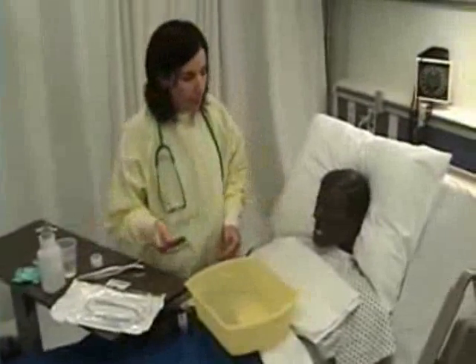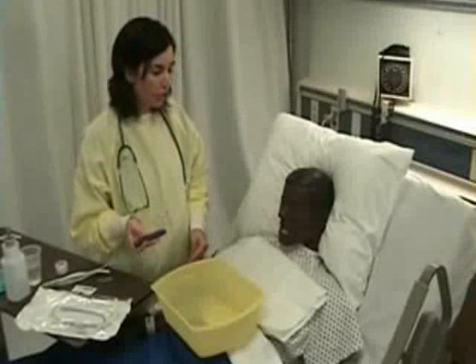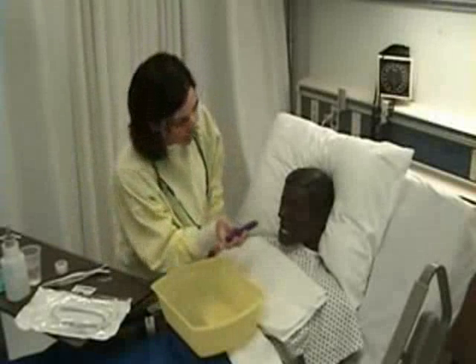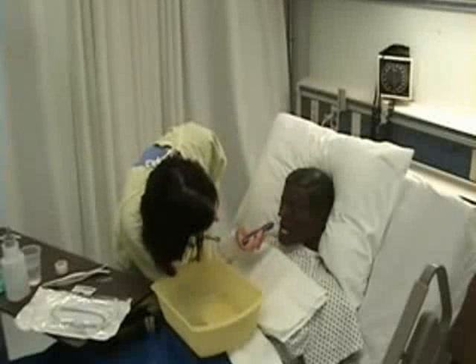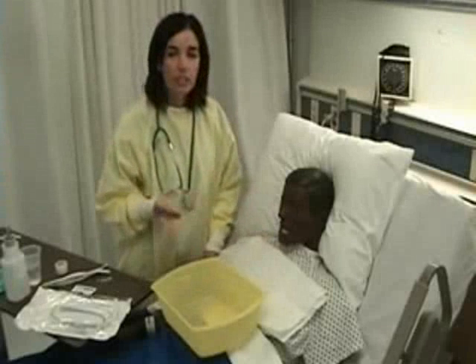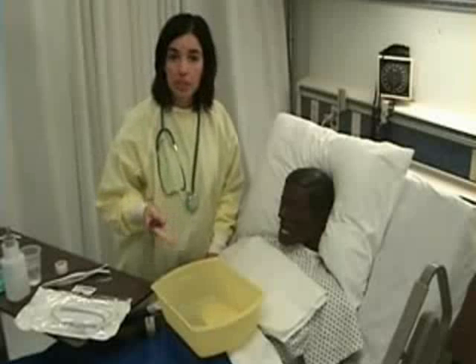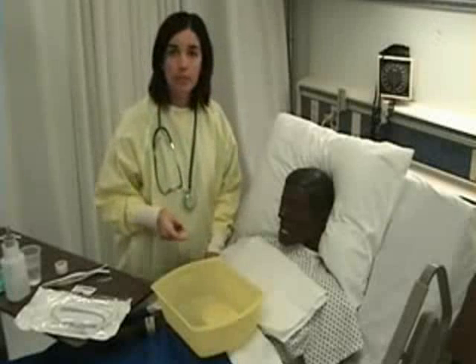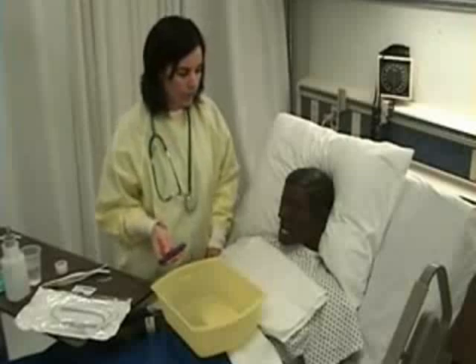I would begin by asking my patient if he's had nasal or sinus surgery, if he's had a fractured nose, deviated septum. I'm going to take my pen light and check both nares to make sure that they're patent. And it looks like on this patient, I will go through the left naris. Other considerations for not placing the NG tube would be a patient that has had gastric bypass surgery, with esophageal varices, alcoholism, liver disease, any bleeding disorders. So that is part of our thorough assessment.